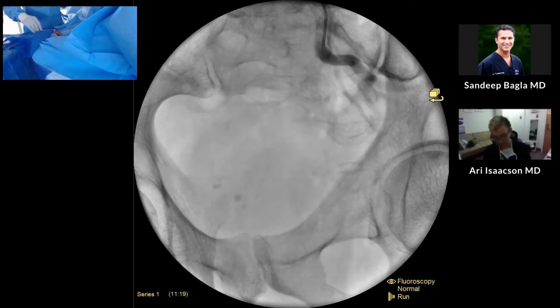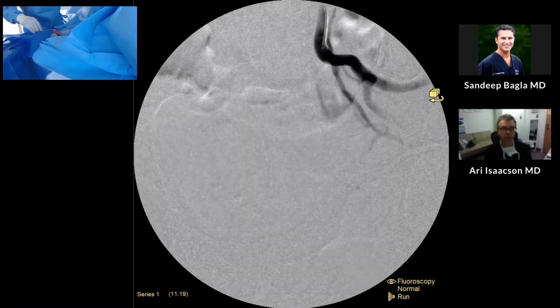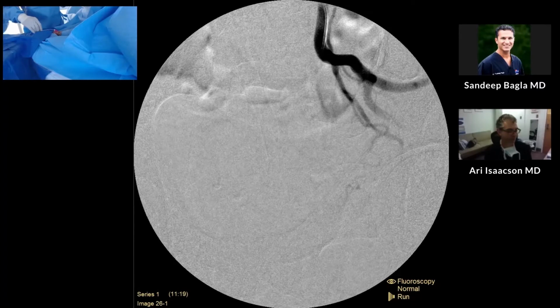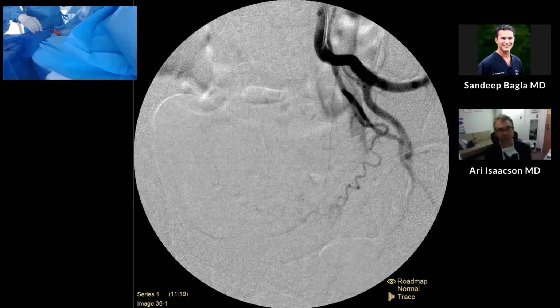The other thing that we will take into consideration now is that we have new longer catheters, should we want to use a longer catheter, that go up to over 170 centimeters in length. Which catheter is that? Today we're using the TrustSelect catheter, and that's what we'll be using to get access to the prostatic artery itself. It comes at 175 centimeters in length, 2.0 French. That's a new option for us. Previously, we were really only able to work with a 150 centimeter 2.0 French as the max.